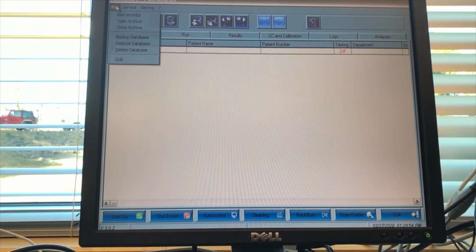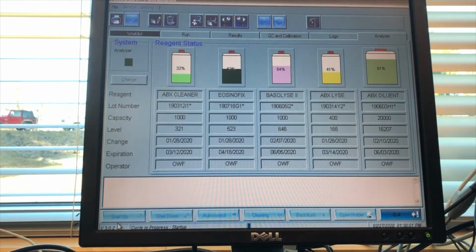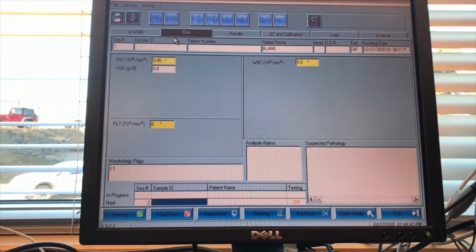So after we've done file, new work list, we can go down to startup right here. And now the startup will take a few minutes, and so I'll pause the video and we'll come back after the startup is complete. So our startup is complete.